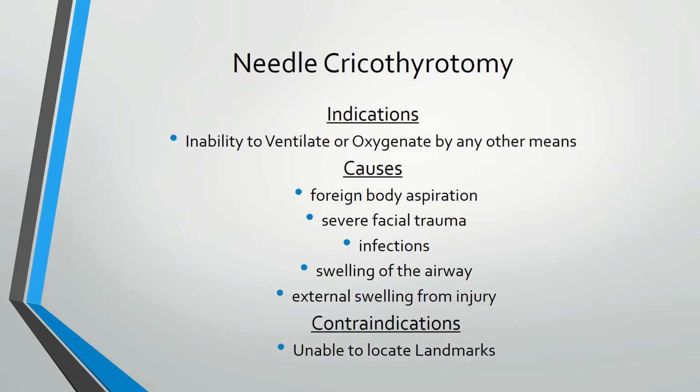You can't really find a whole lot of contraindications because this is a last-ditch effort for these patients. The only main contraindication you'll find a lot of times is if you can't locate your landmarks, which we'll talk about in a little bit. You don't need to be sticking a needle in somebody's neck if you can't find where it's supposed to go.